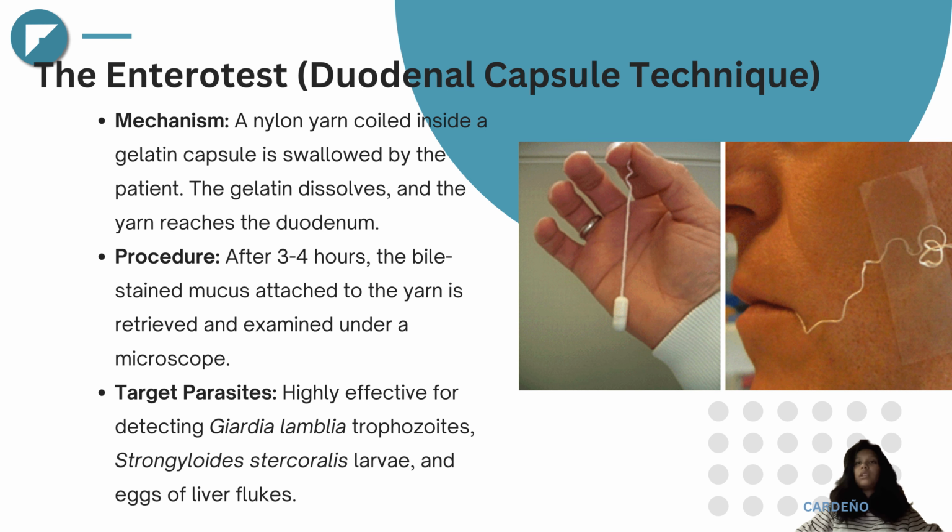Enterotest or duodenal capsule technique. This non-invasive method involves swallowing a gelatin capsule containing nylon yarn. Once dissolved, the yarn reaches the duodenum and collects bile-stained mucus. After retrieval, the sample is examined microscopically.